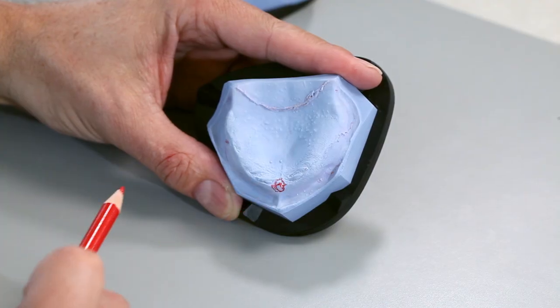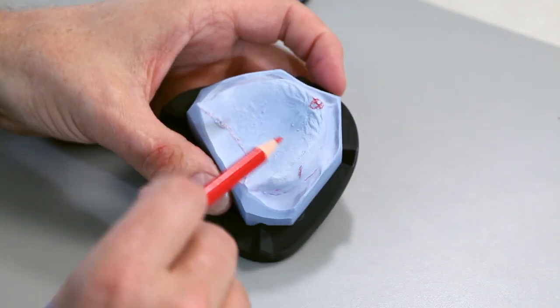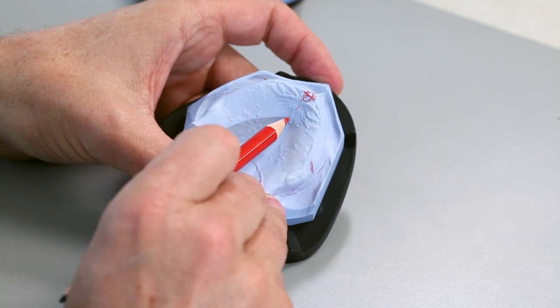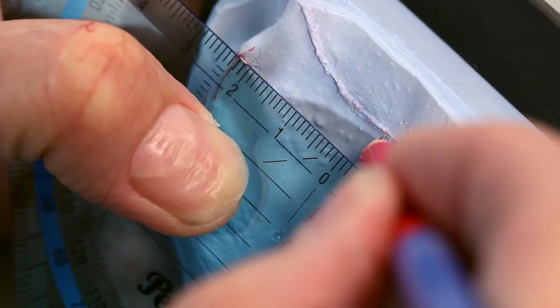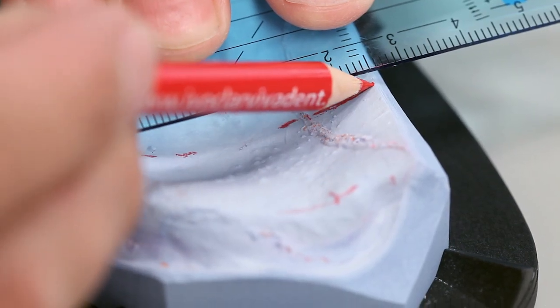The following anatomical reference points are the basis for further working steps: papilla incisiva and the palatine raphe, which forms the anatomical midline. Extend the palatine raphe up to the dorsal area and transfer it to the model edge.